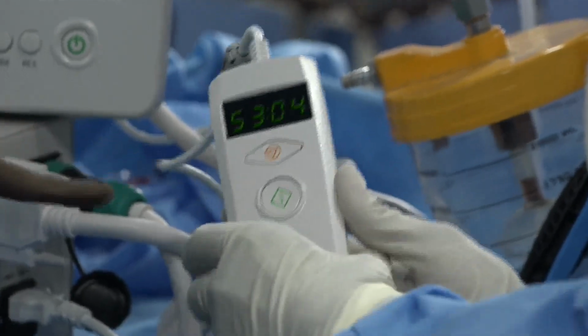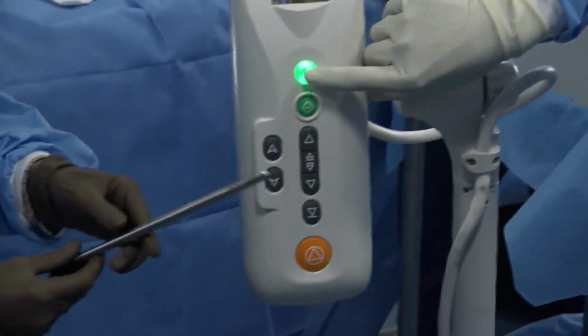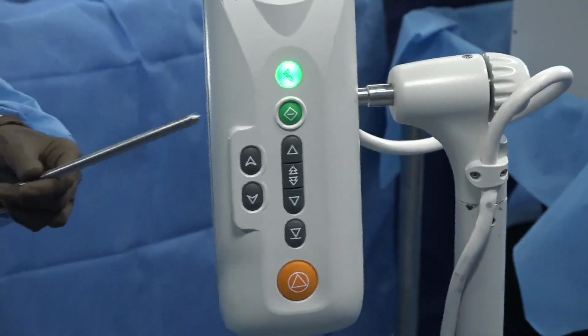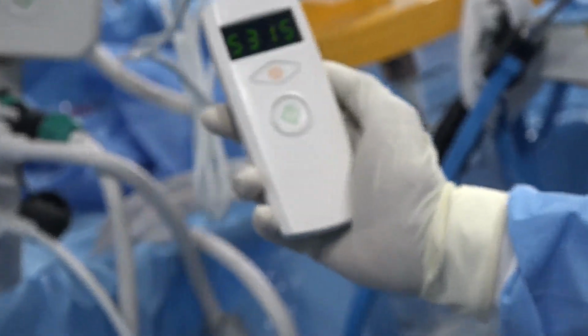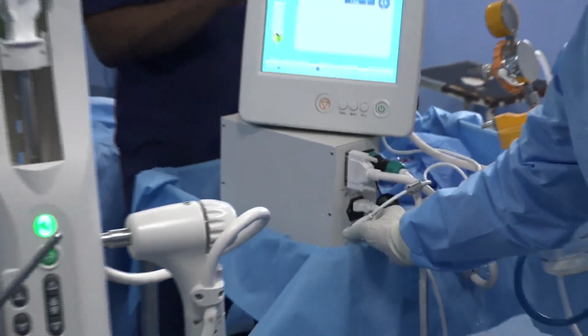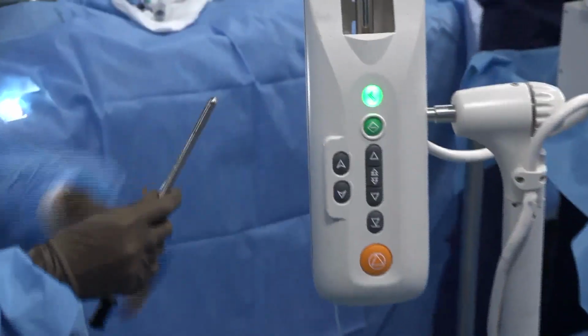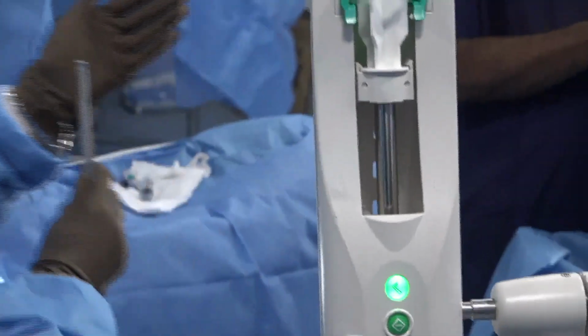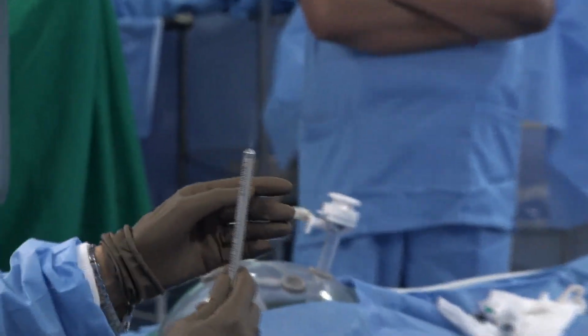He is going to push the button, and you can see. Press this injector, then we can go out, and to start, we'll just push this one once. Now the system is charging up, and in a while you will see, can you see this? The mist is coming out. Yeah, so it's called a Swiss snowstorm.